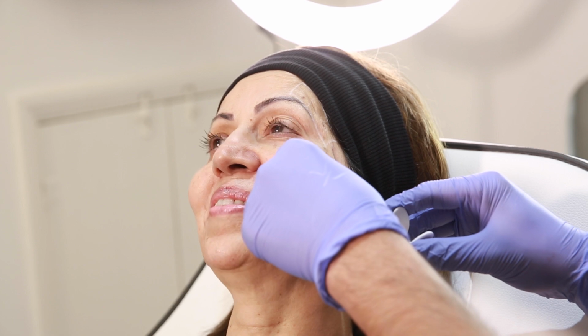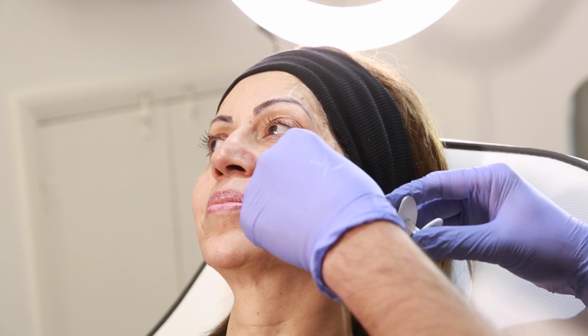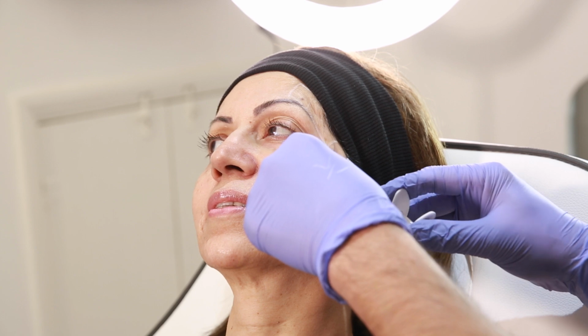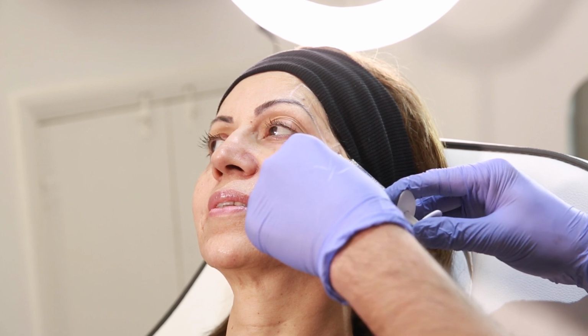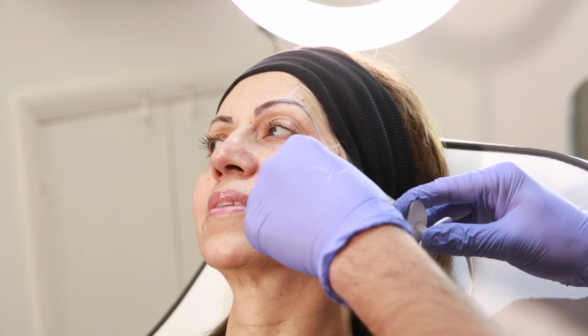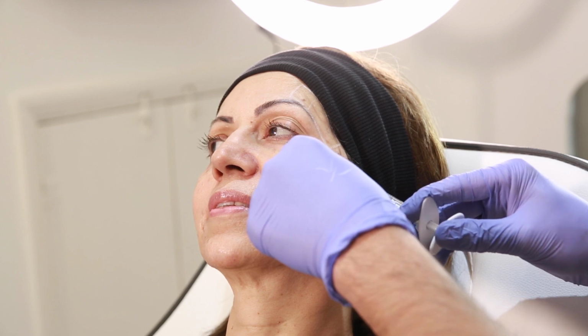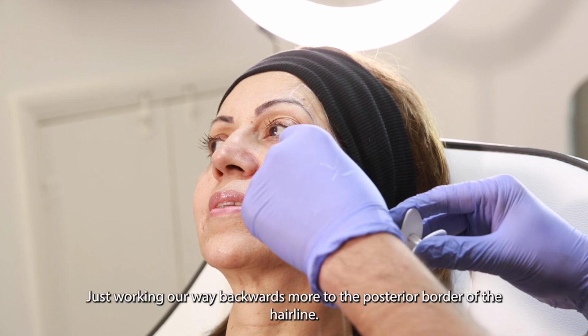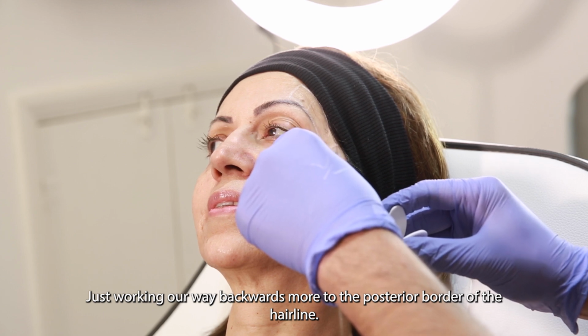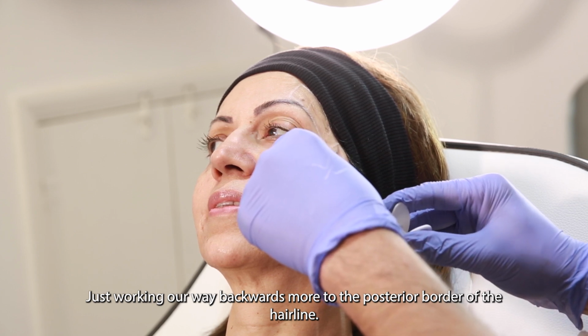You okay? Yeah. Just working our way backwards more to the posterior border of the hairline.